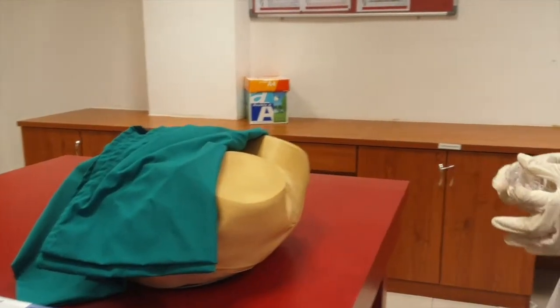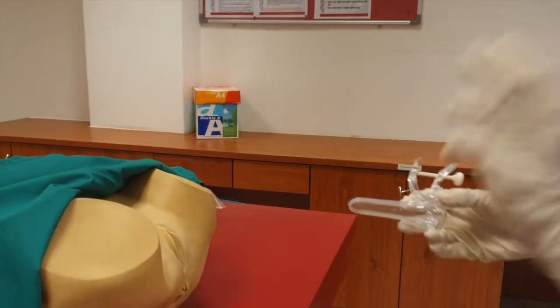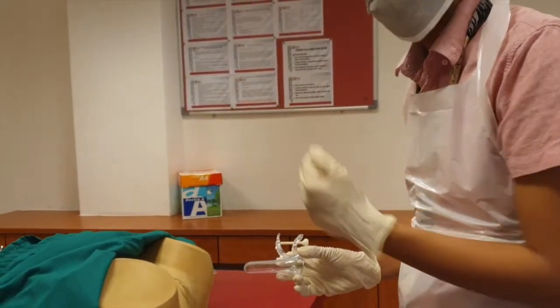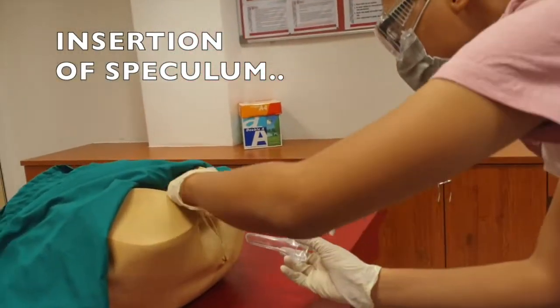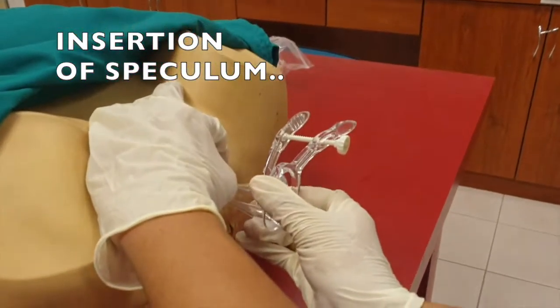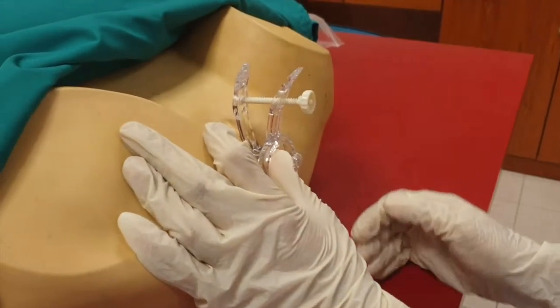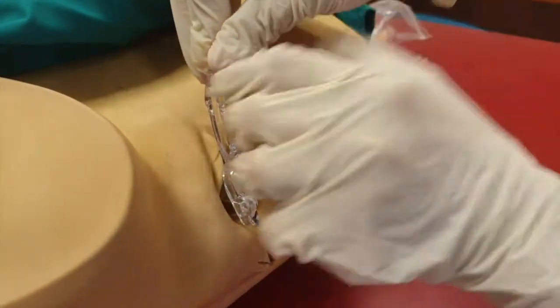Okay puan, saya akan mula masukkan speculum ni. Mungkin dia akan sakit ataupun tak selesa sikit lah. Nanti kalau sakit beritahu saya puan, boleh ya. So ask permission to insert the speculum to the patient. Then carefully we insert it. Okay puan, saya masukkan. Insert the speculum, and then you rotate it until the handle is directed over the 12 o'clock or anteriorly, and then you open the speculum and make sure you fix it, you screw it in place.